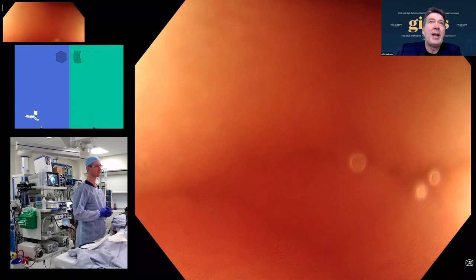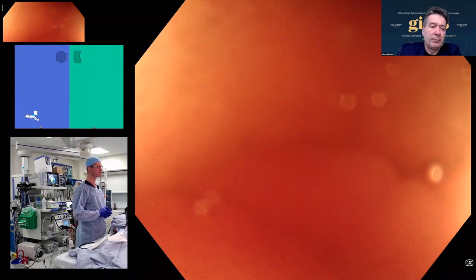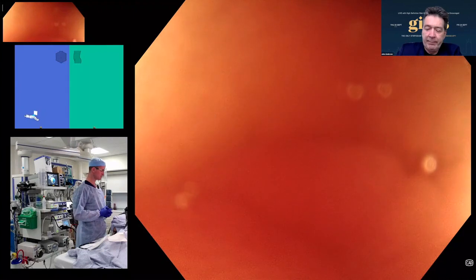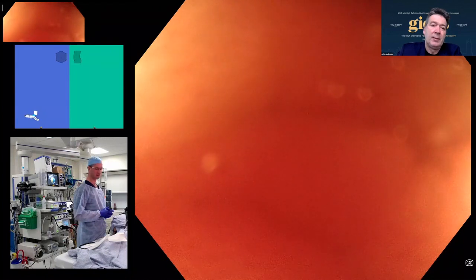It's a CF, so it's an adult colonoscope. Okay. Yes, not a PCF. So what would you choose if you had a choice, do you think? And why? Because of the surgery, or is this question regarding the surgery? It is relating to the surgery. That is correct.